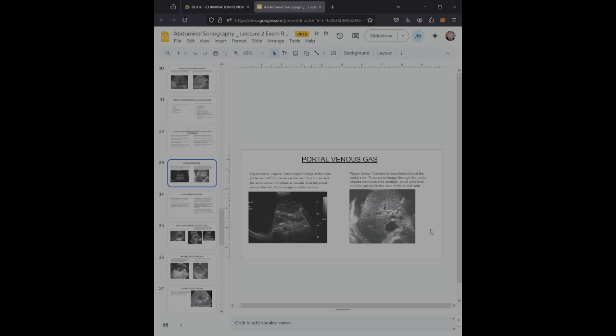So there are certain clinical findings of portal venous gas. They can be a recent bout of diverticulitis, appendicitis, or inflammatory bowel disease. They can be ulcers within the bowel, a GIT cancer, or an invasive procedure involving stent placement, or an endoscopic analysis of the bowel. Sonographic findings include small, bright reflectors noted within the circulating blood inside the portal vein, and large air collections may produce a ring-down artifact.